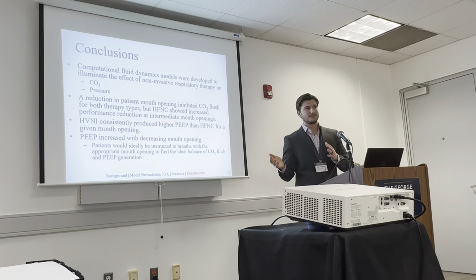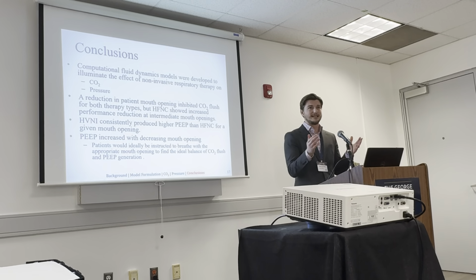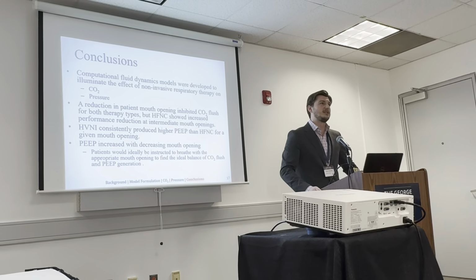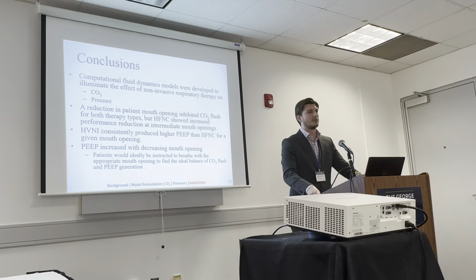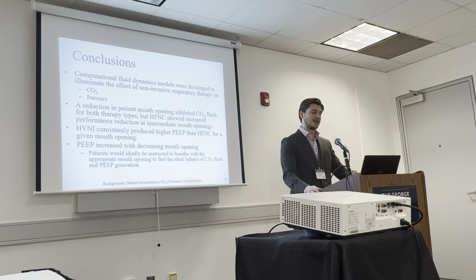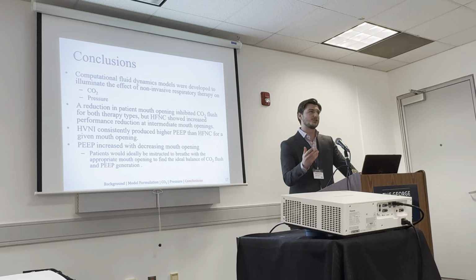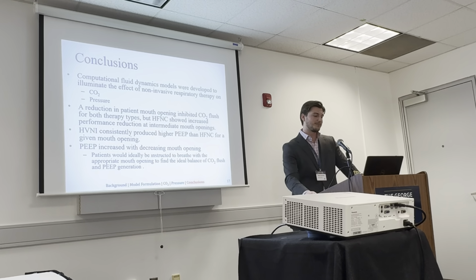So ideally, clinicians would instruct patients to breathe at some intermediate mouth opening, depending on what they're looking for. If they're more worried about CO2 retention, then they would simply instruct the patient to open their mouth more. If they were more concerned about pressure, then they would have them close the mouth.